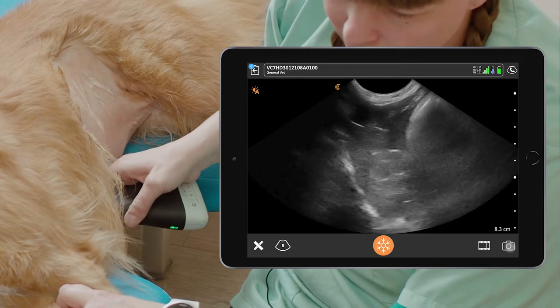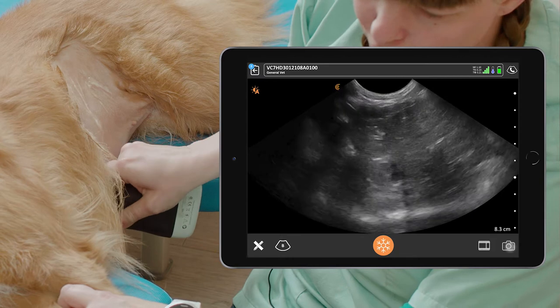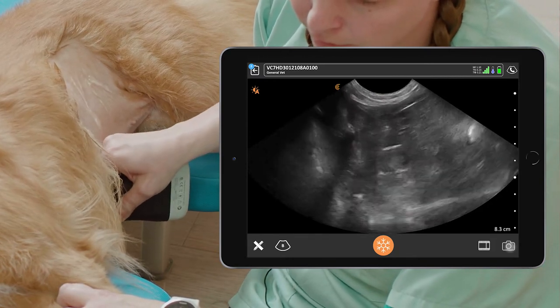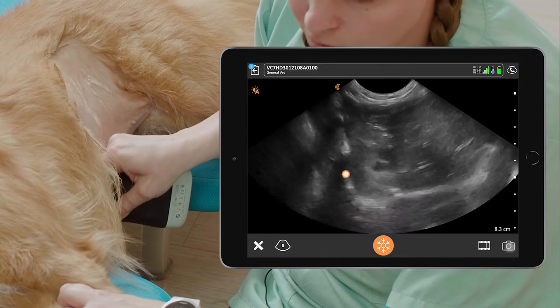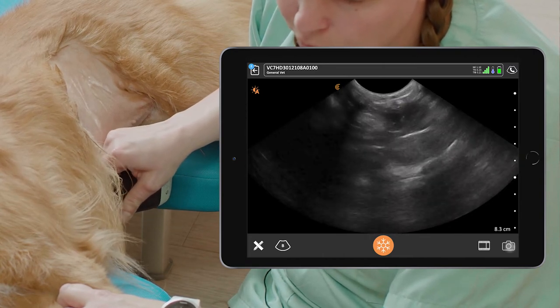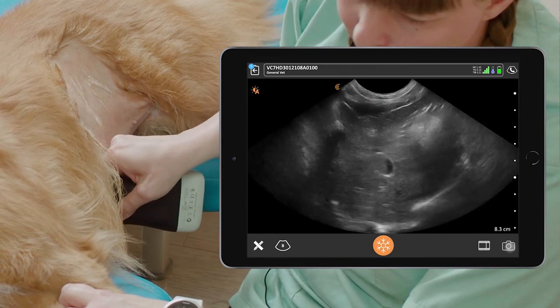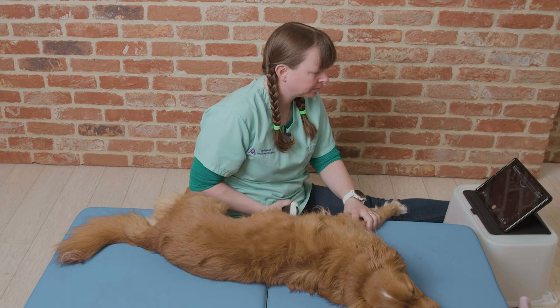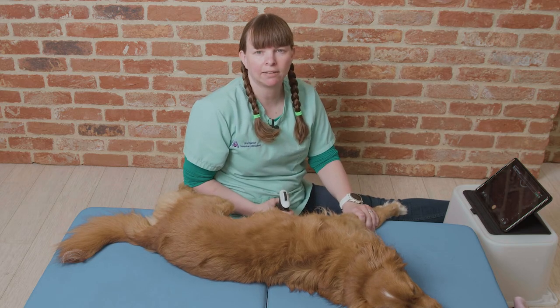Once we've scanned in that plane, we want to rotate the probe to get a transverse view of the liver. We can see the diaphragm is now horizontal across our screen, and then we can fan through first cranially and then caudally until the liver disappears in each direction. And that's how to scan the liver in a dog.